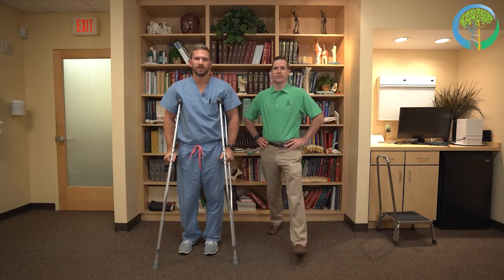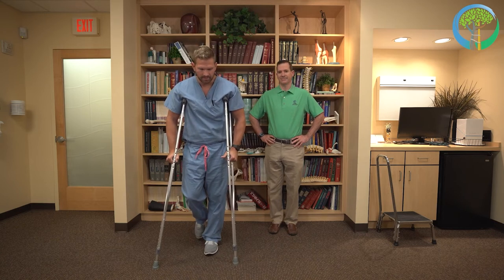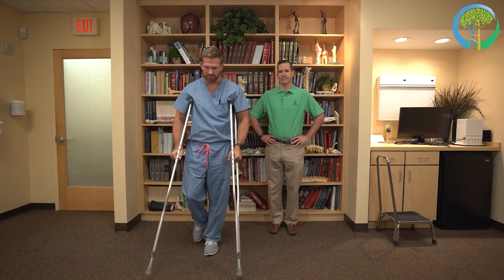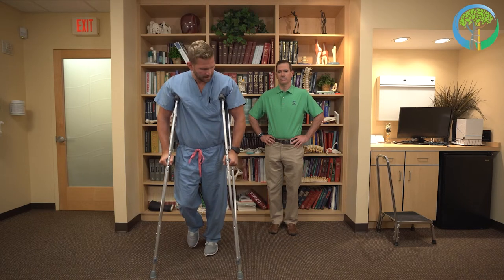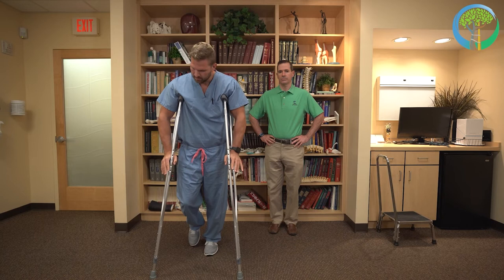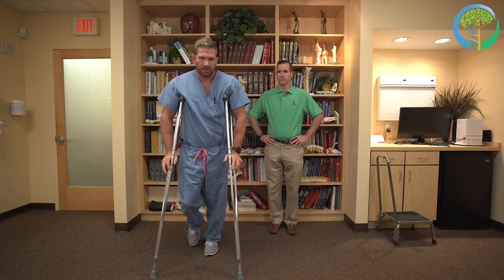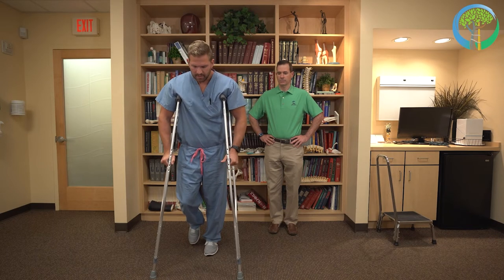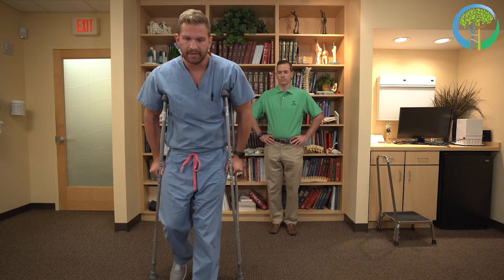Kyle will now demonstrate how to properly use crutches. For this instance, his right leg will be the injured leg, so he keeps his weight off of that leg. He moves the crutches forward, then pushes off his uninjured leg. Notice his weight is through his hands with his elbows at a slight bend — all his weight is not on his armpits. He pushes off of his uninjured leg and swings forward.